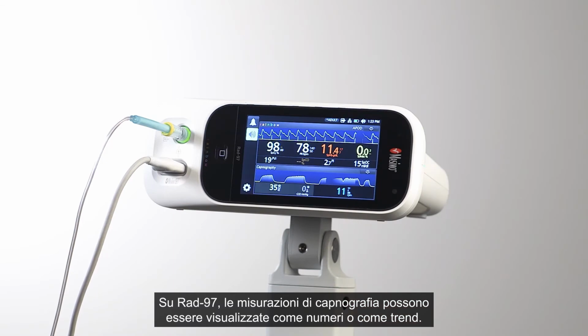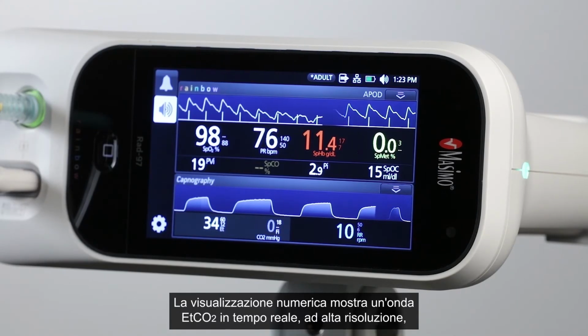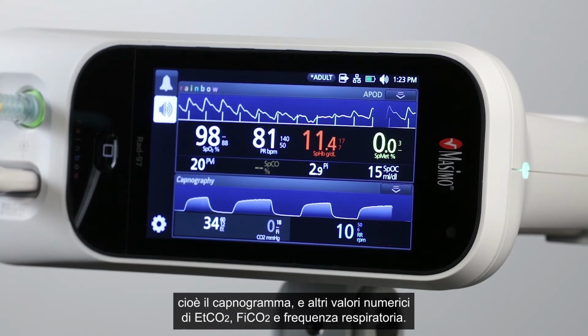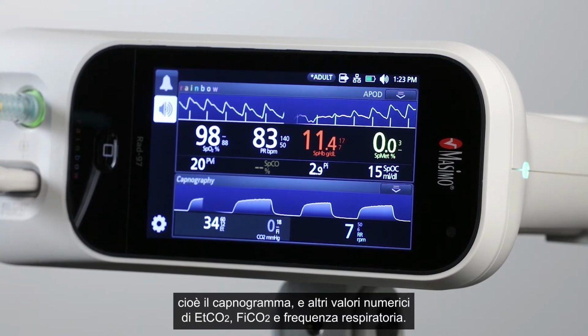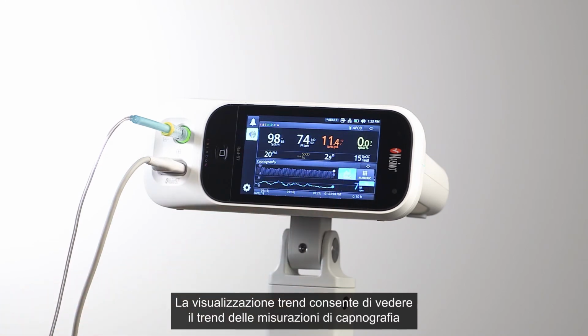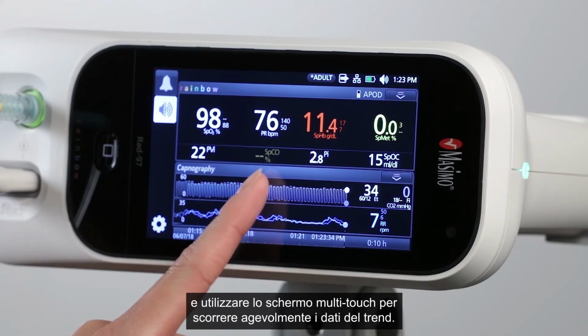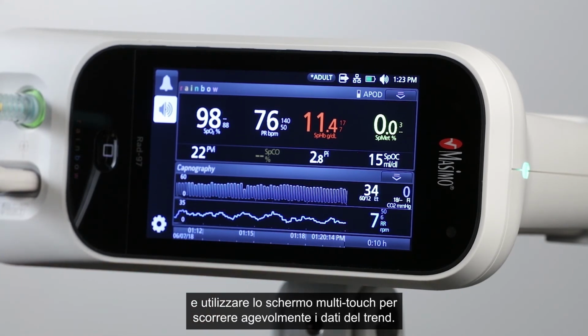On Rad-97, capnography measurements can be displayed in numeric or trend view. Numeric view features a high-resolution real-time ET-CO2 waveform, or capnogram, as well as numeric values for ET-CO2, FI-CO2, and respiration rate. Trend view allows clinicians to trend capnography measurements and use the multi-touch screen to easily scroll through trend data.